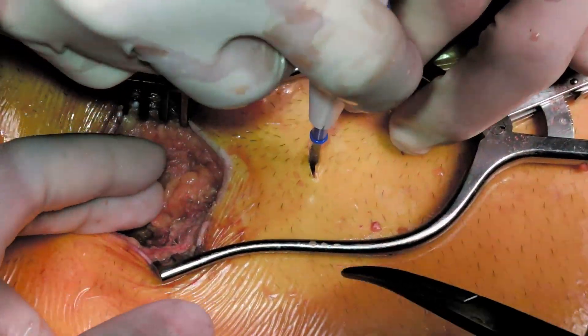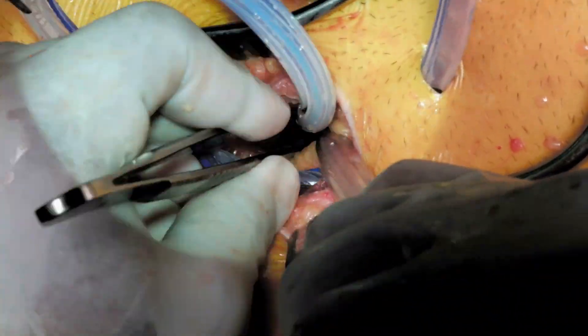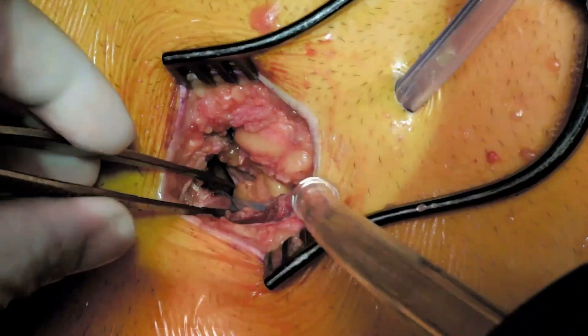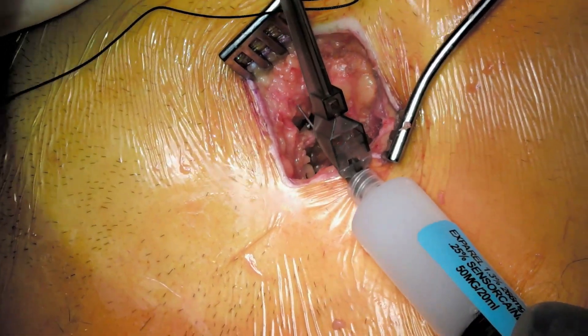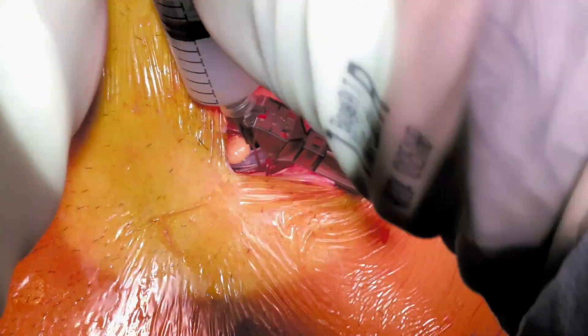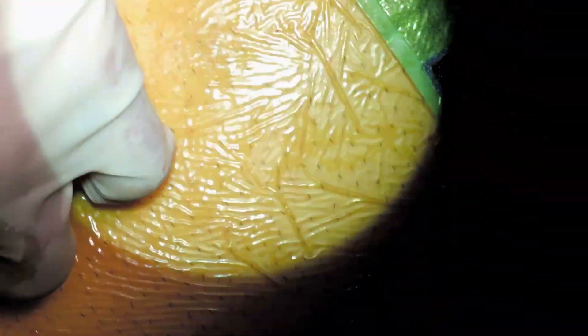After draining the pericardial effusion, I get ready to place a drain in the pericardial space. I made an incision in the skin — that's my 24 French drain that I'm now putting around the heart. That drain will stay around the heart for about 48 hours to remove any residual fluid. I'm also injecting local anesthesia around the tissue and incision site so that when the patient wakes up, he's not having too much pain. Next I'll start to close the incision and secure the drain.